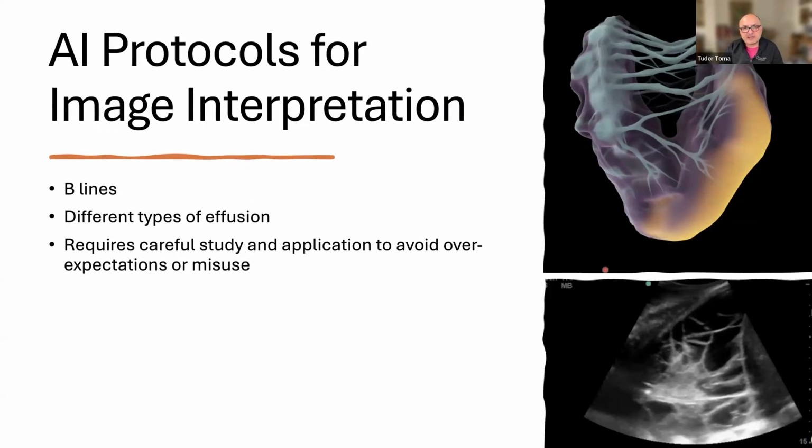In terms of AI, a field which is very close to my interest and heart is the possibility to expand the image interpretation with AI. At the moment, we have this B-line assessment, which is an AI assessment of B-lines.